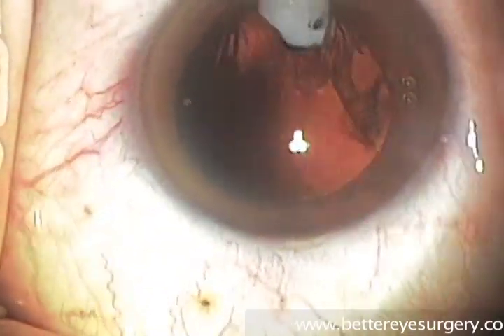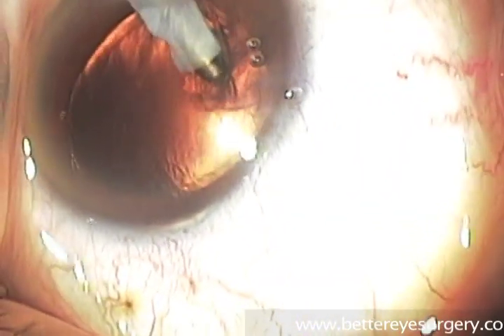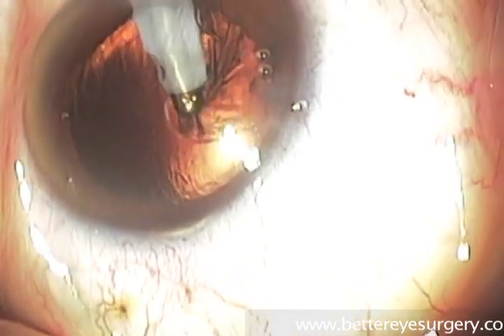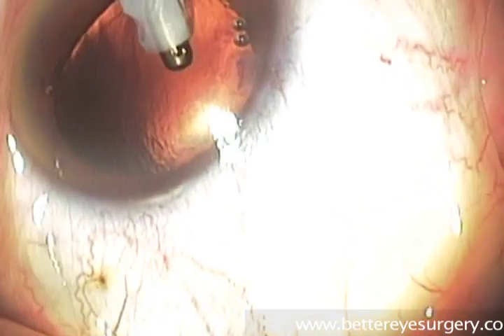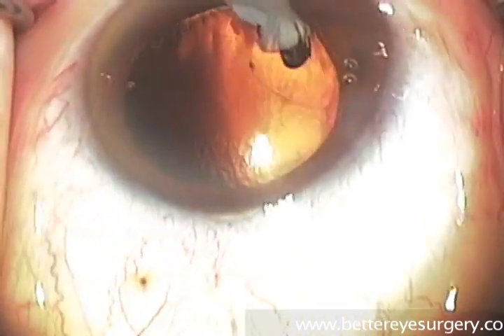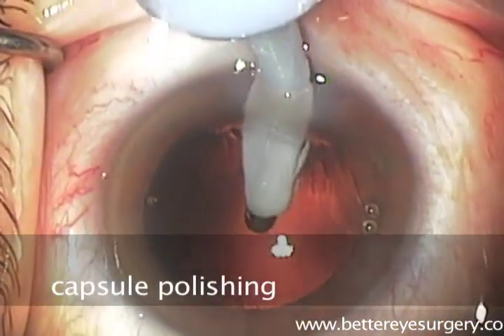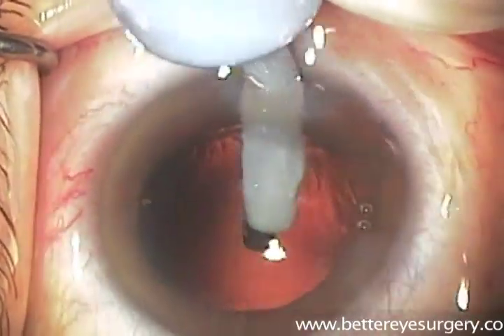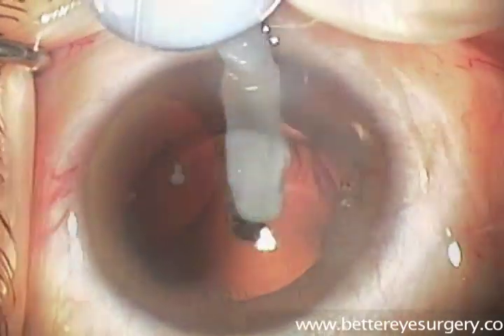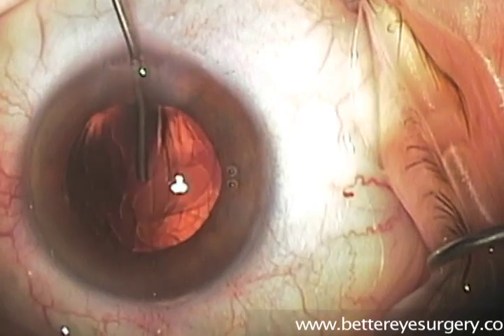These pieces of lens cortex are now removed using a silicone sleeve around an instrument with a much smaller opening. We want to have great control of the amount of tissue removed here so that we don't damage the lens capsule. The irrigation aspiration tip is placed near the pieces of cortex that remain, and then using a foot switch to control the vacuum, the surgeon can gently vacuum the back capsule of the lens of the eye.